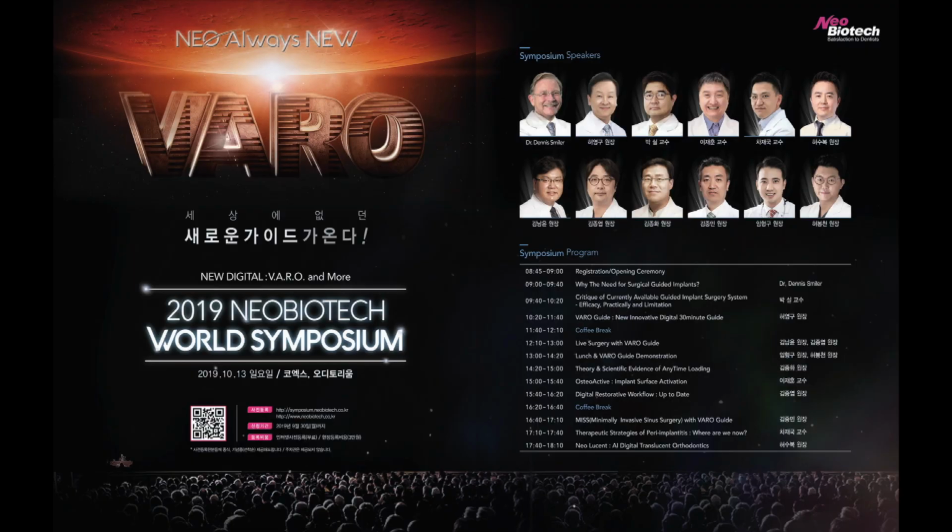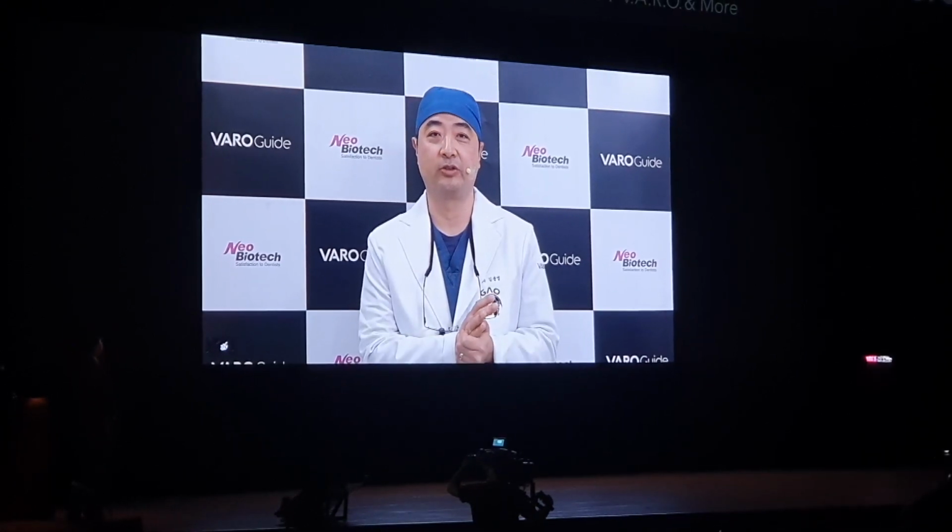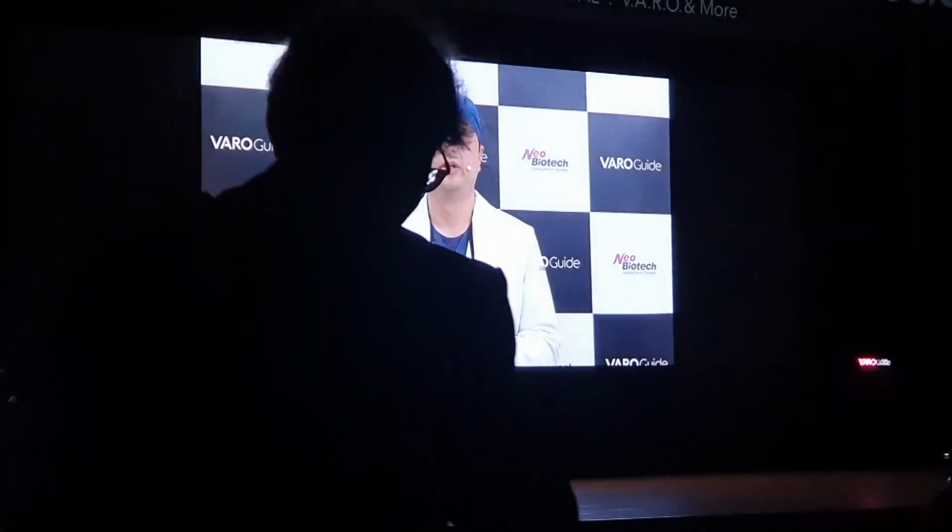Let's check it out. The patient has missing tooth number 16. It's healed. Today's live surgery will demonstrate step by step how the VARO guide actually works in our practice, from indexing, design, milling to placing an implant procedure. So let's meet the patient and move on to indexing the pre-guide.